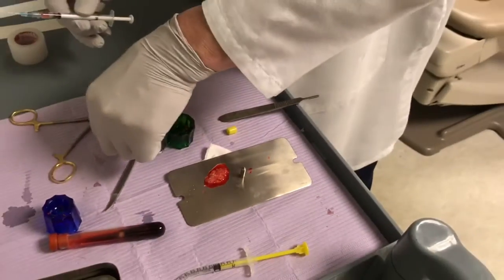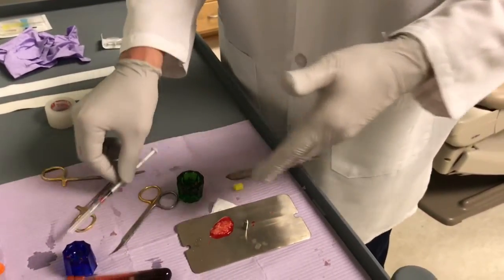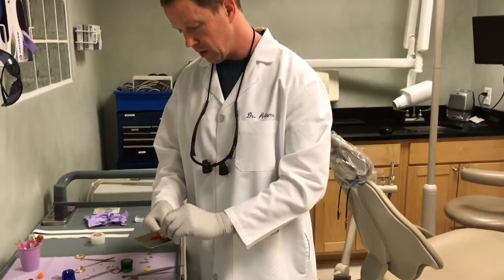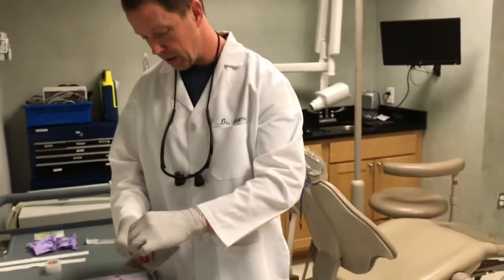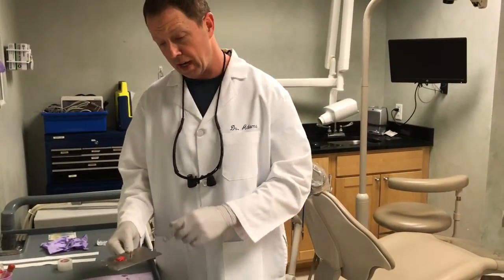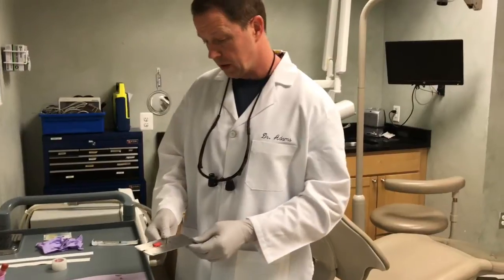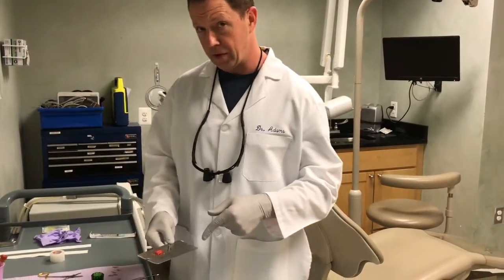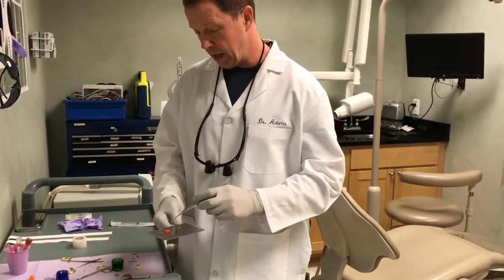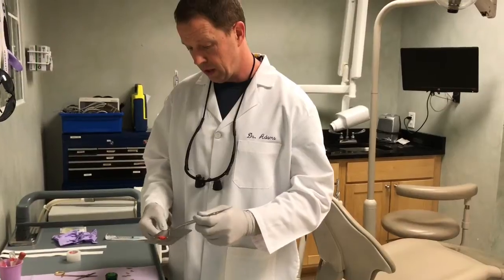I'm going to save a little bit of this so that when we put this into the patient's mouth, I can add a little bit more. After waiting three minutes, the whole point of this preparation is to get a mixture of the bone graft. Now this bone graft is cadaver bone — it's the only part of this product that did not come from the patient. But we have PRF and injectable PRF, which are two different formulas of platelets, white blood cells, and fibrin, and we mix all these things together.